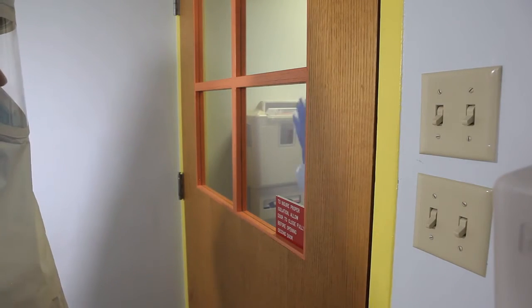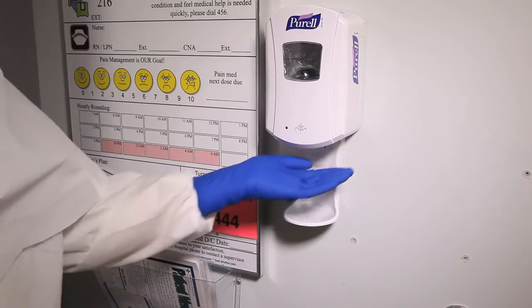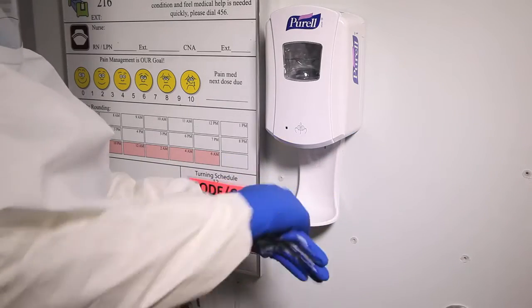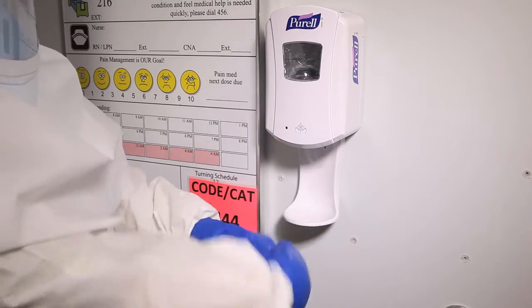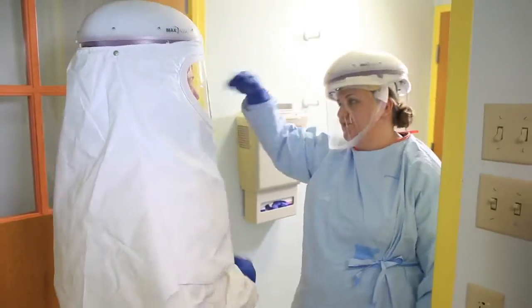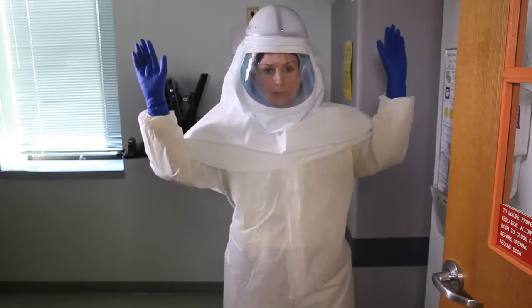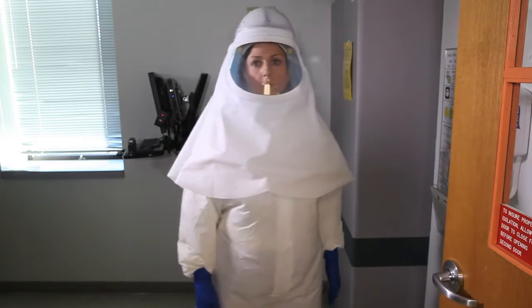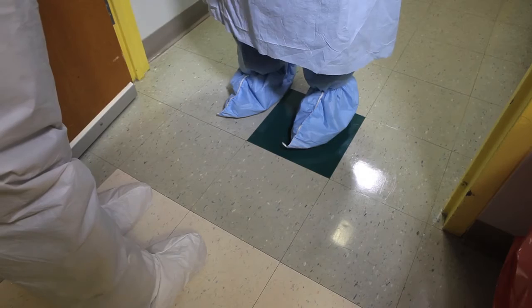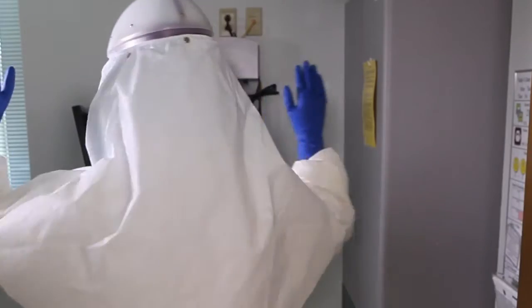Notify your buddy that you're ready to doff your PPE. Sanitize gloves and allow hands to dry before moving to the next step. In the doorway of the patient room and anteroom, turn so that your back is to your buddy. Your buddy will inspect the PPE for rips, tears, and obvious contamination. If obvious contamination exists, disinfect with bleach wipes.